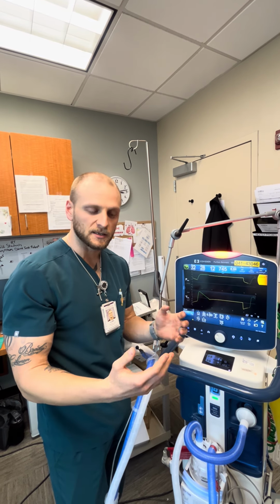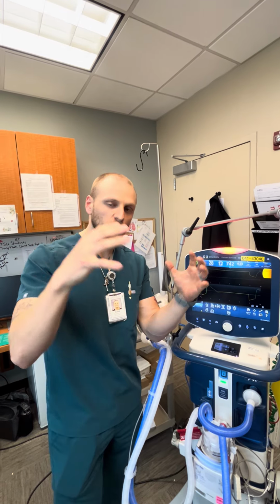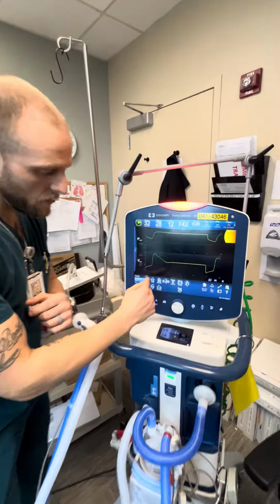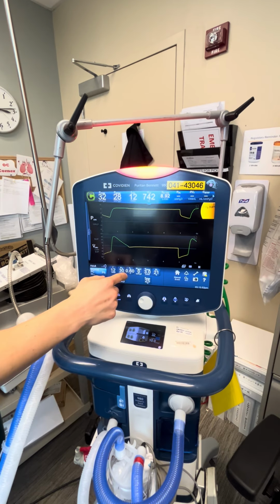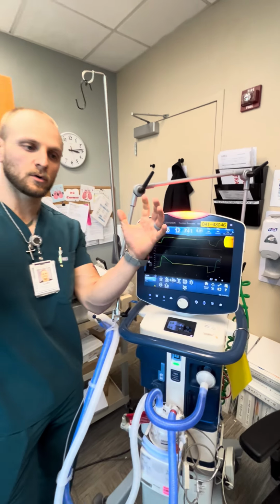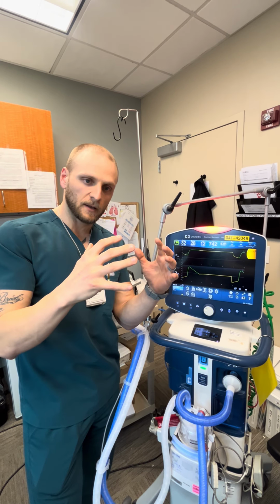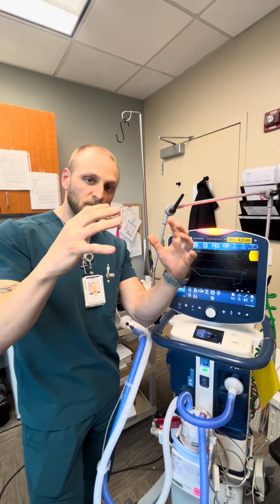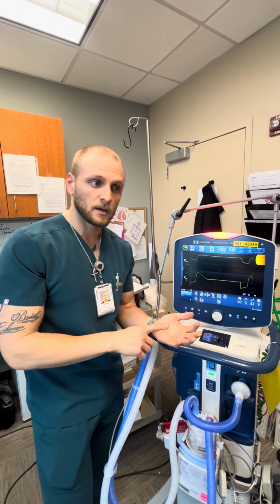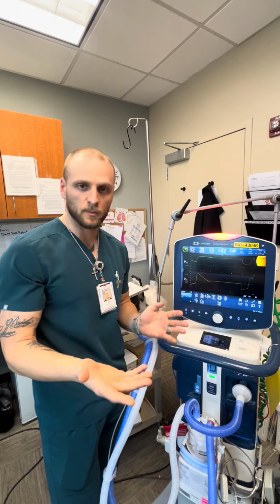And all that means is when we inflate our patient's lungs 12 times a minute, we're going to drop them from that pressure, right? That's where your frequency comes from. During that 12 breaths, we're going to drop them for 0.6 seconds, okay? But during that 0.6 seconds, we want to make sure that we're not collapsing those lungs. That's why we need to know our peak expiratory flow rate to where we can adjust to stop that lung at an appropriate time to where we keep our oxygenation obviously good, and then our compliance and our alveoli open, okay? How do we do all that mumbo jumbo, right?